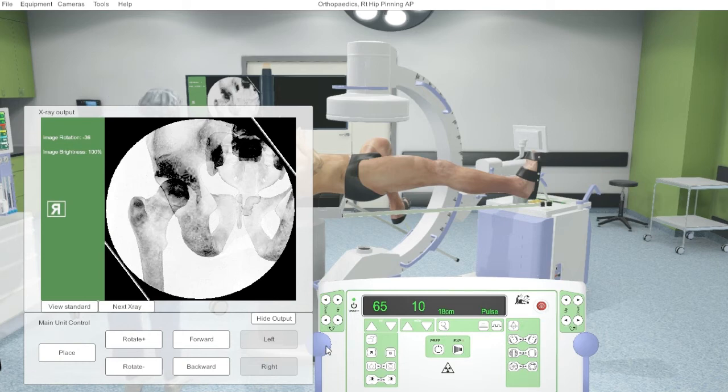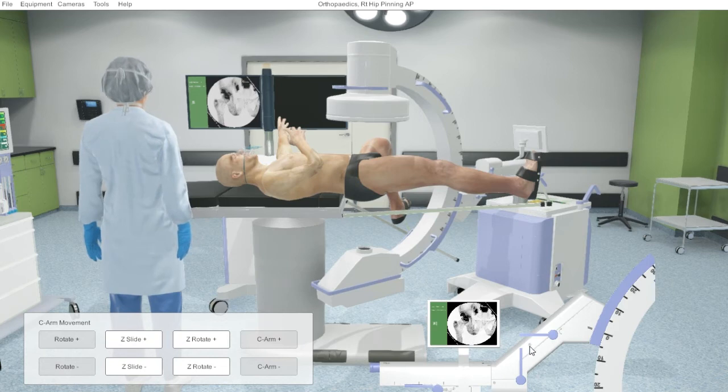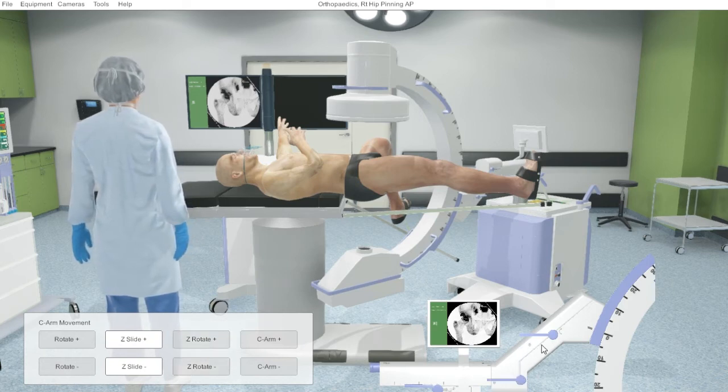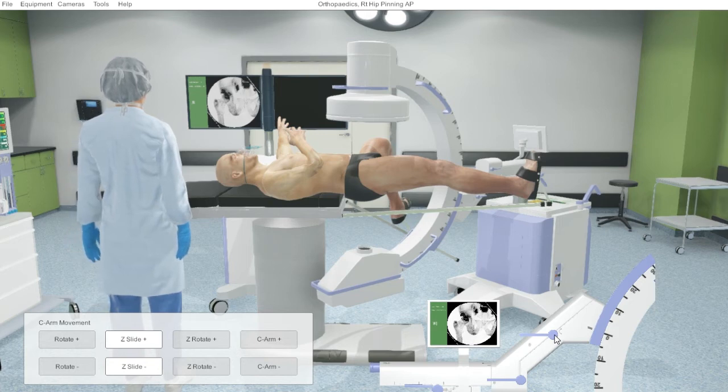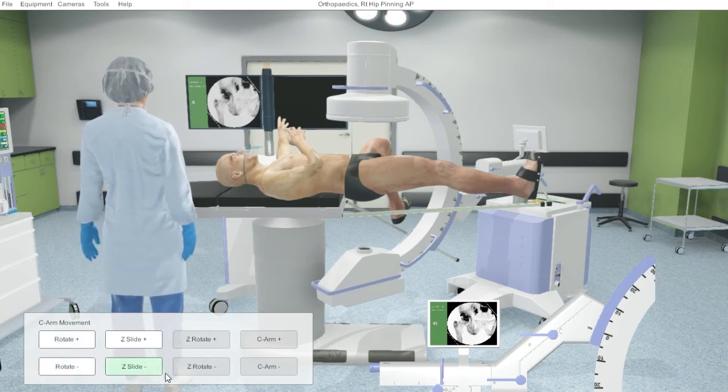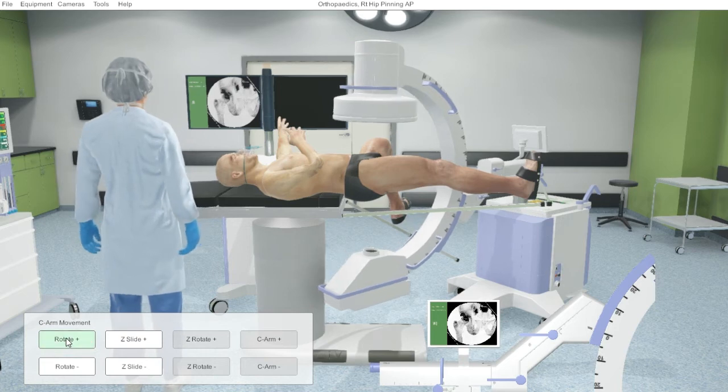So by clicking on these locks, we enable different movements to occur. We have the rotation, the slide, the z-axis rotation, and forward and back.